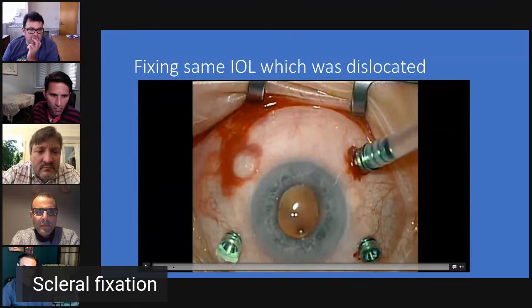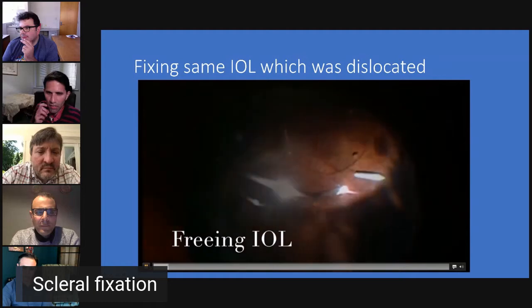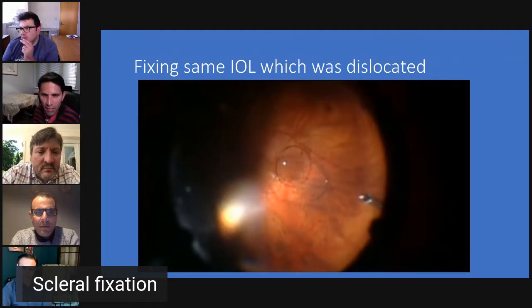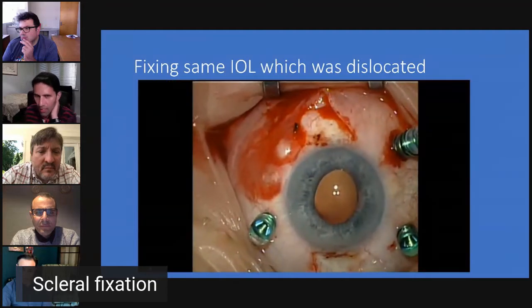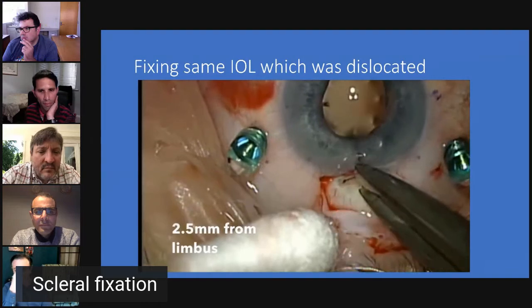This is a similar sort of, I'll be very brief with this one. This is an IOL that is dislocated. This guy's minus 5, was made to be minus 5. And as Chris showed in his first video, he's got a dislocated lens. It's important to free it from the vitreous. And then because he was minus 5 in both eyes, I wanted to fix the same IOL into place. And this is already a three-piece IOL.